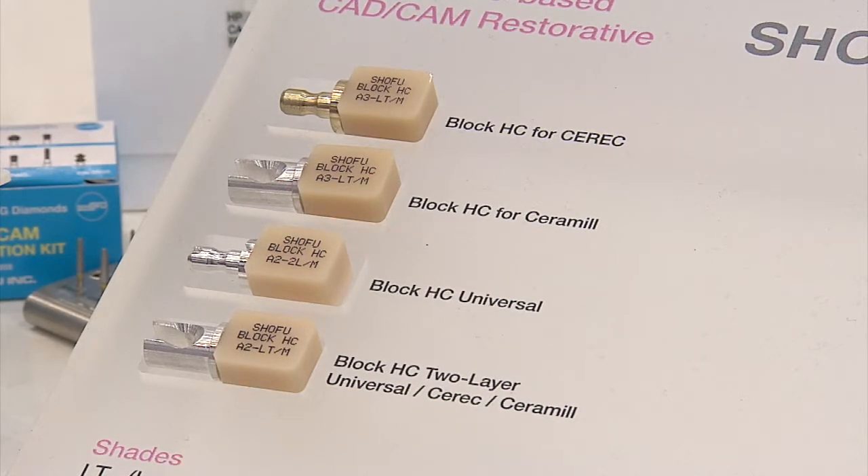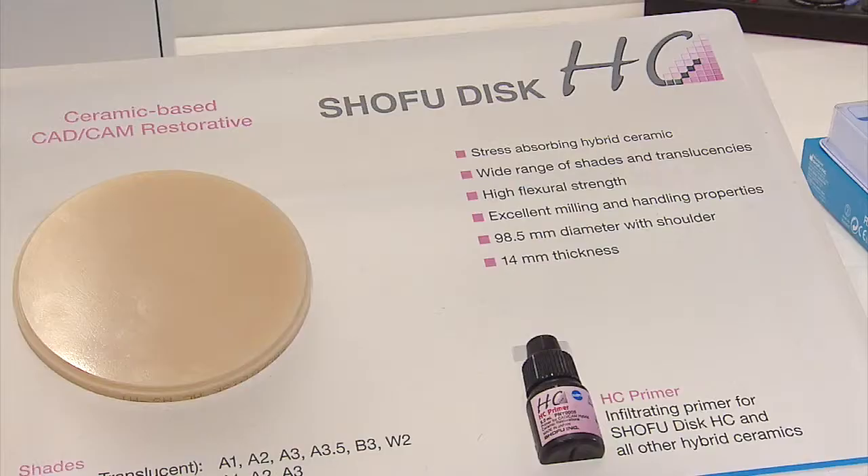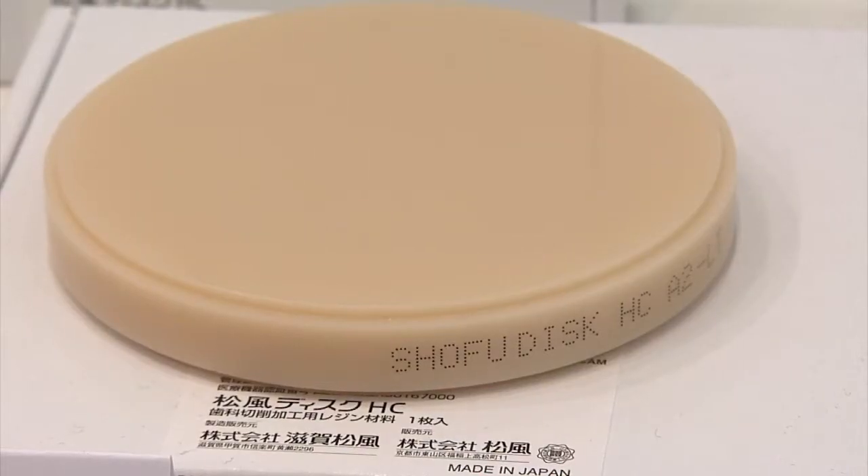It comes along with a newly developed cementation system which addresses former failures of this type of material. And I can only highly recommend to try it.